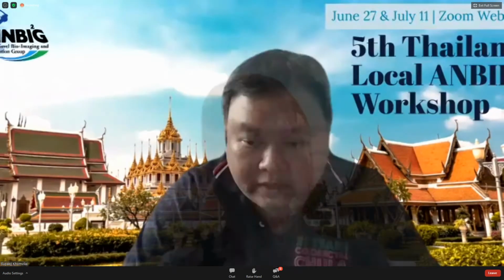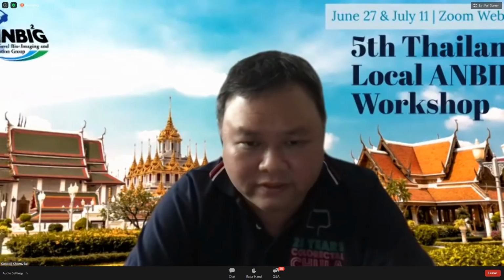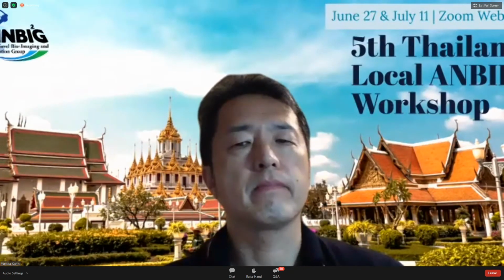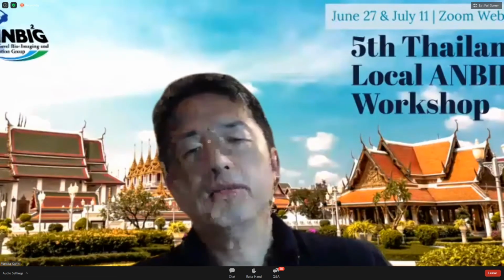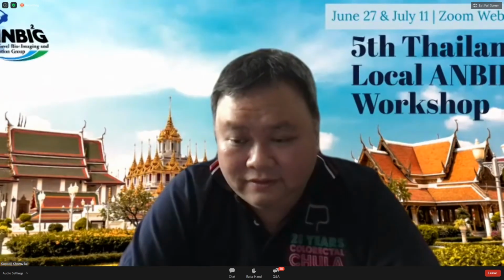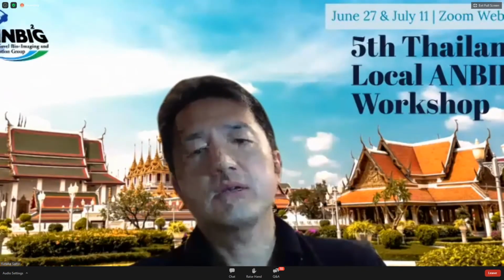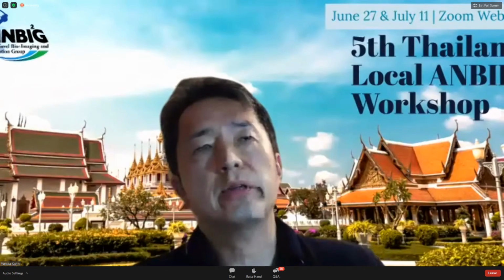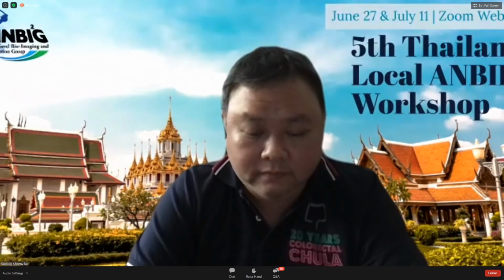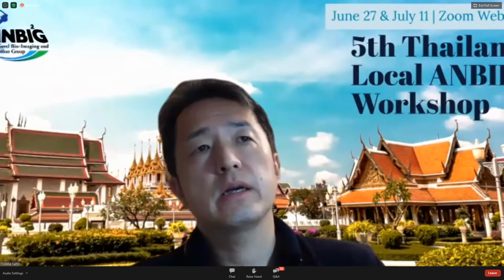Yes. Okay. And then there was one more question from the audience. They're asking about the role of diagnostic ESD. What is your suggestion? Yes. Diagnostic ESD is a little bit difficult because it sometimes depends on the endoscopic diagnostic level. But in the past, because we had no good technique for R0 resection, especially for large lesions, if we suspected some cancer invasion, we tended to send the patient to the surgeon.